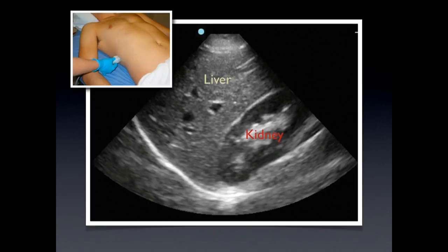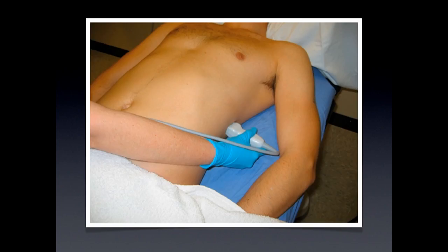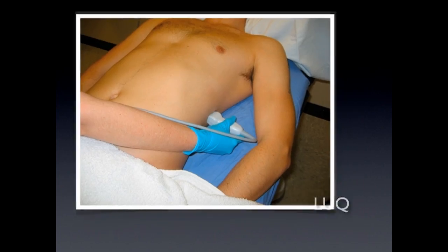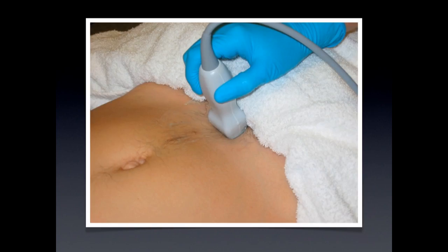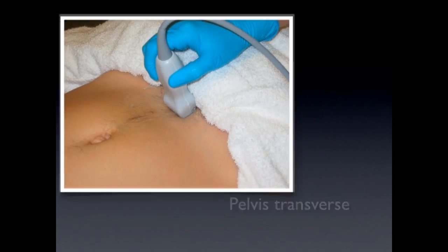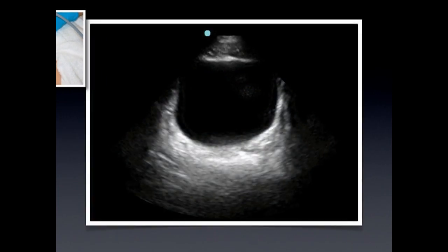You want to make sure there's no free fluid in that area. Next, the left upper quadrant — we're looking for the splenorenal space. It's a little bit more tricky to get; your hand needs to be almost all the way down to the bed so you can clearly visualize the spleen, and sometimes you have to work around and make sure you have rib shadows. Last, the suprapubic area in the transverse plane will show us the bladder.